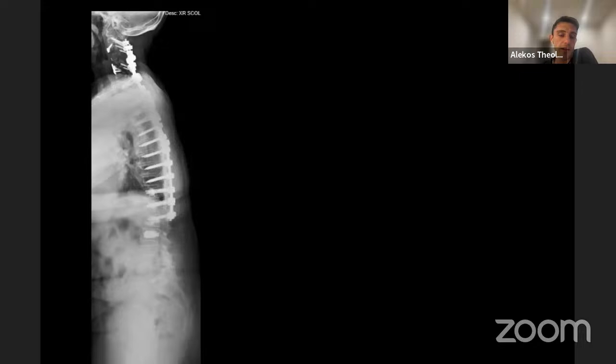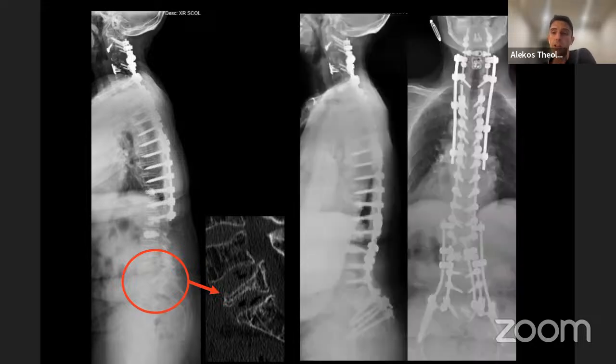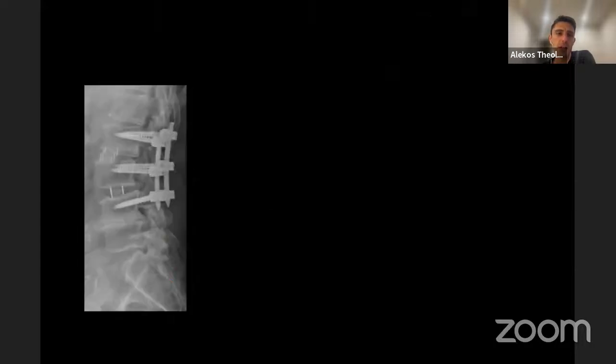And then instead of distal failure, she actually developed an L5 compression fracture from her poor bone quality. And this decompensated her sagittal plane more. And she also had stenosis associated with this. So we extended her down to the pelvis. Overall, she did okay. I think alignment-wise, she's respectable. Took care of her neurologic symptoms, but you can see how quickly this can really decompensate, going from an isolated cervical issue, a tumor, down to the pelvis very rapidly.